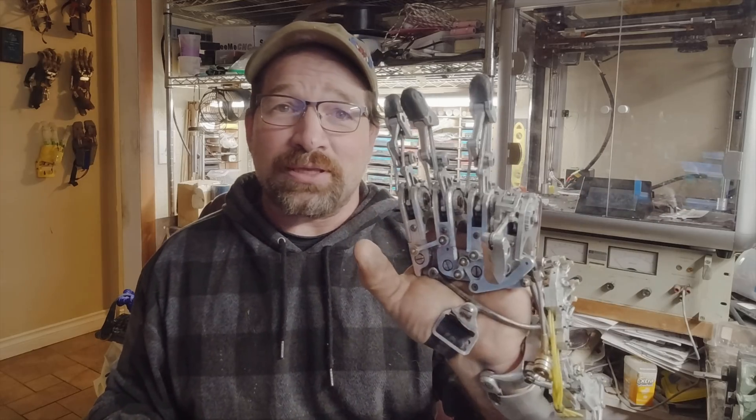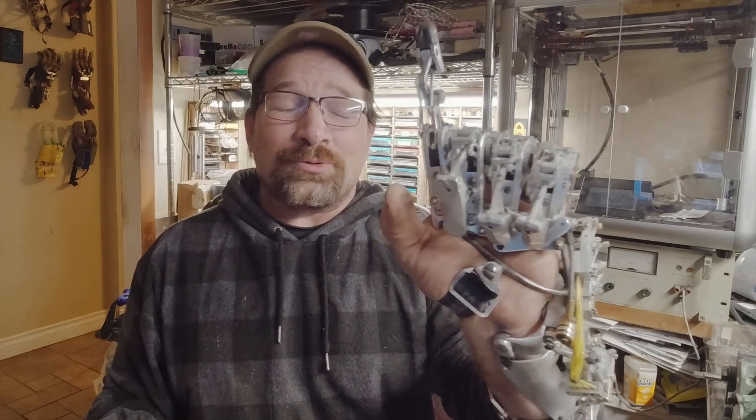I'm now able to go from open and close like normal. One click: pinkies locked. Two clicks: ring and pinkies locked. Third click: ring, pinky, and index locked — or ring, pinky, and middle locked — and then back to open.